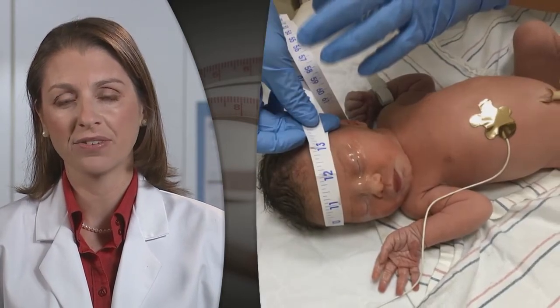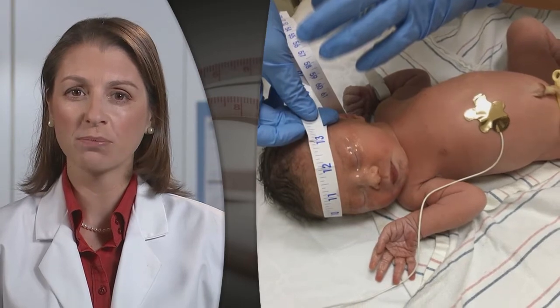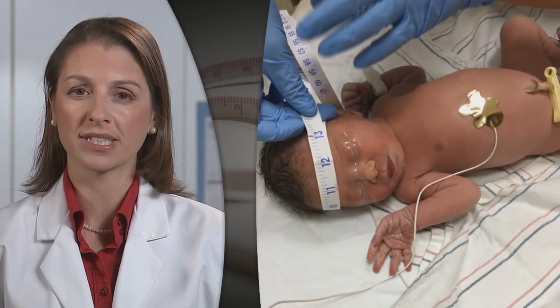To assess an infant for microcephaly, a clinician measures the newborn's head circumference. It is important that healthcare providers measure head circumference in the same way, consistently, to accurately identify if an infant has microcephaly. This is especially important in the midst of the Zika outbreak because correctly identifying infants who may have Zika-associated microcephaly can help health authorities connect them to the services they need.